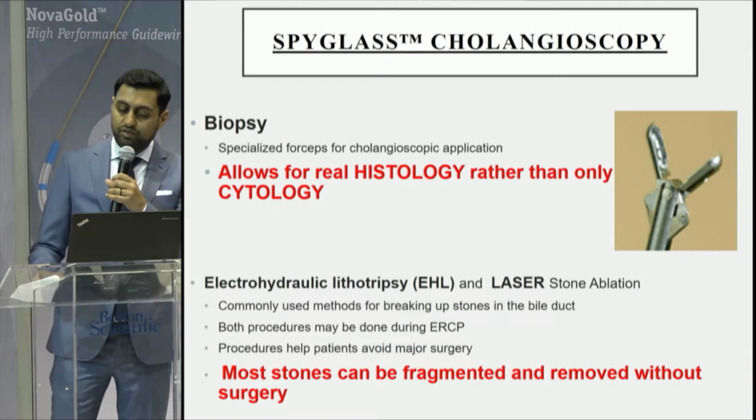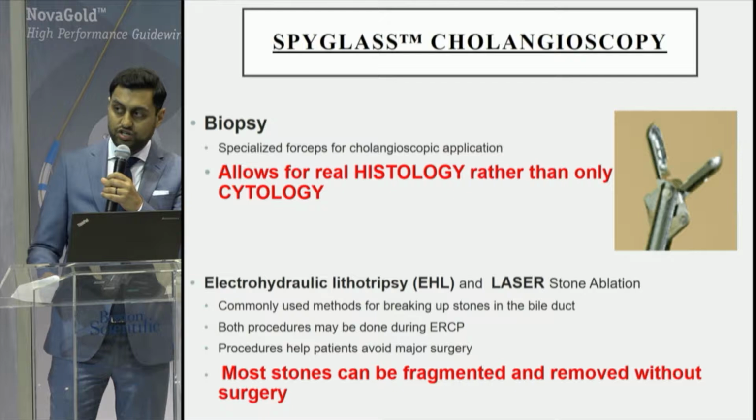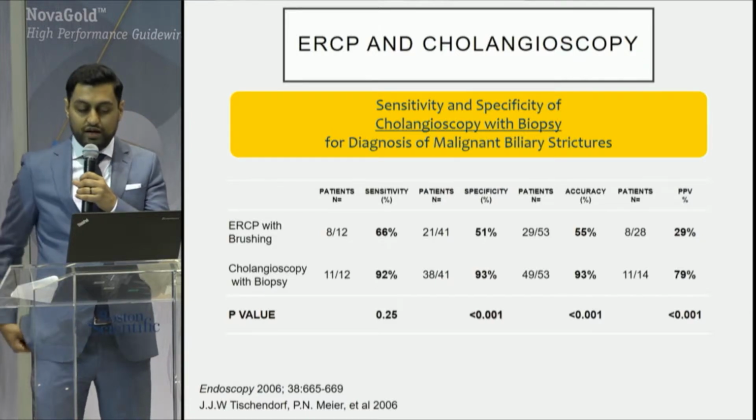And then finally, we have the applications of electrohydraulic lithotripsy and laser for the destruction of stones. It's not related directly to this talk, but it allows us to move into the realm of therapy. So I really like this slide.